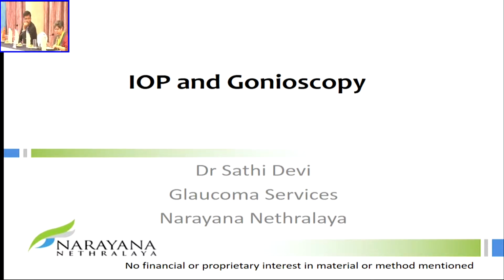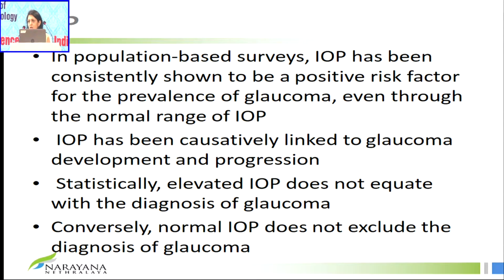Very good afternoon. So I'll be speaking about intraocular pressure and gonioscopy. So we all know that intraocular pressure is a risk factor for glaucoma. It has been causatively linked not only to the development of glaucoma, but also with progression of glaucoma.